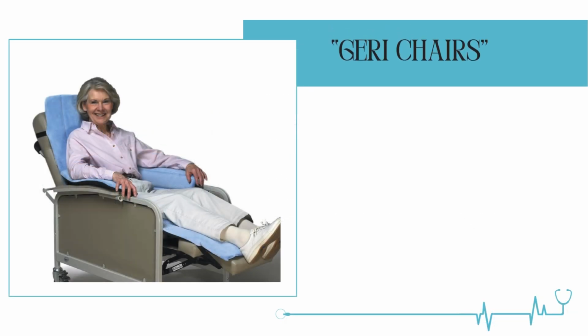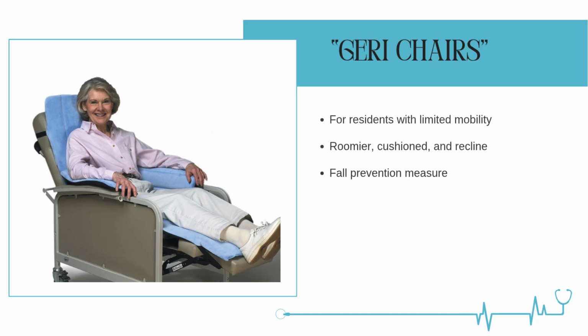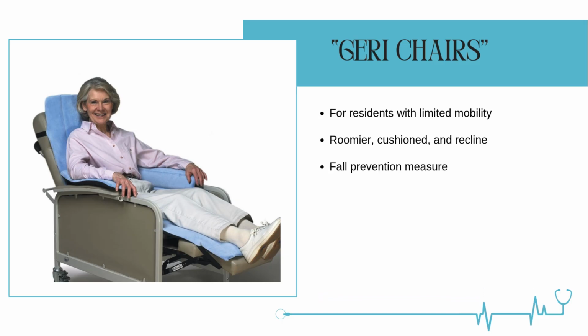Geriatric chairs, or geri chairs, are large chairs designed to help individuals with limited mobility. When compared to transport chairs, geri chairs are easier to lounge in, because they are roomier, are cushioned, and can recline. Geri chairs are frequently used as a fall prevention measure, as they often have higher sides than conventional wheelchairs to keep residents from falling.